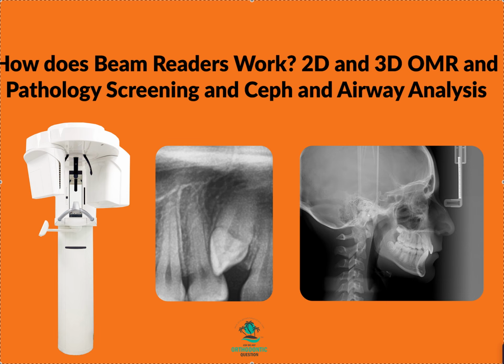So in some ways it almost works like direct-to-consumer aligners. That's what I'm familiar with, where there were so many doctors in each state. I'm not saying this is direct-to-consumer, because it's not, but in terms of there being someone licensed in your state, at least one person that will do your reading, and it takes a few days for them to write up that report, giving you the okay to go ahead and do whatever, or to read for pathology. And they do lots of other things that are not related to orthodontics, so you can ask them what they do. But this is the stuff that I'm interested in.